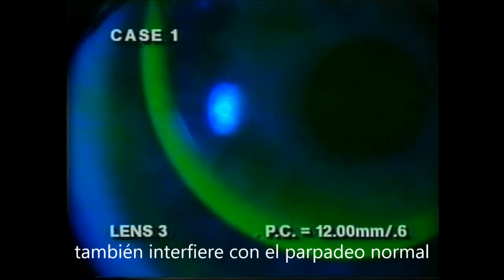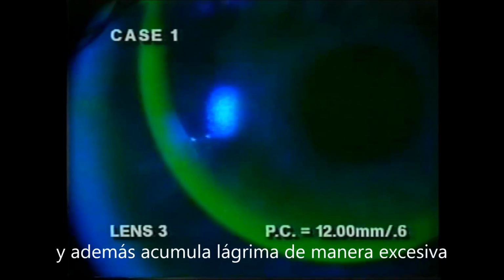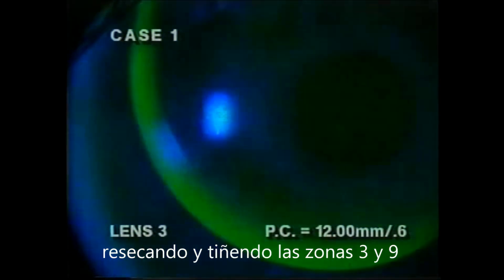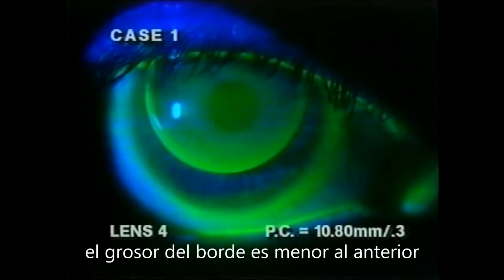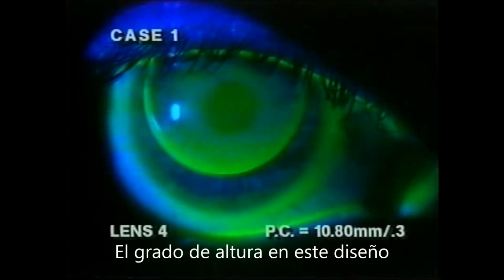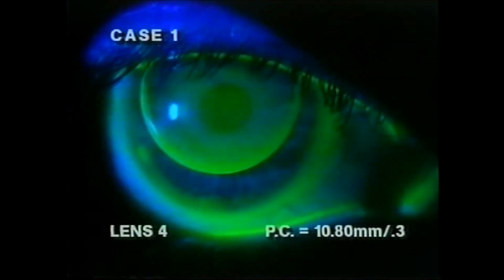A high edge lift design potentially interferes with normal blinking and can funnel excessive tears underneath the lens. This can lead to lens edge awareness and 3 and 9 o'clock staining. With this lens, notice the peripheral fluorescein band is narrower than the previous example. To decrease edge lift, this design features a steeper peripheral curve and a narrower curve width.